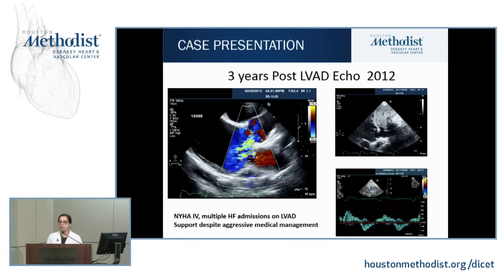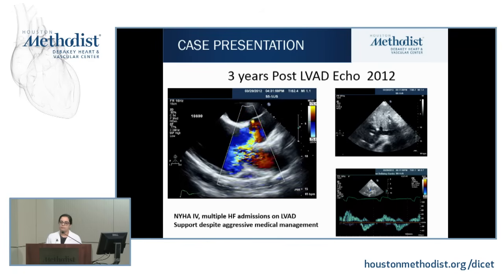So that whole notion that it develops over time is also something that I think is variable, and it's changing with different VADs that we're using. Why that occurs is that in pathology studies, they've looked at the cusps, and the cusps over time kind of fuse and form holes. So one of the things that we're looking at is CT may also be helpful, because you can see cusp fusion on CT scan if you have a good CT scan.